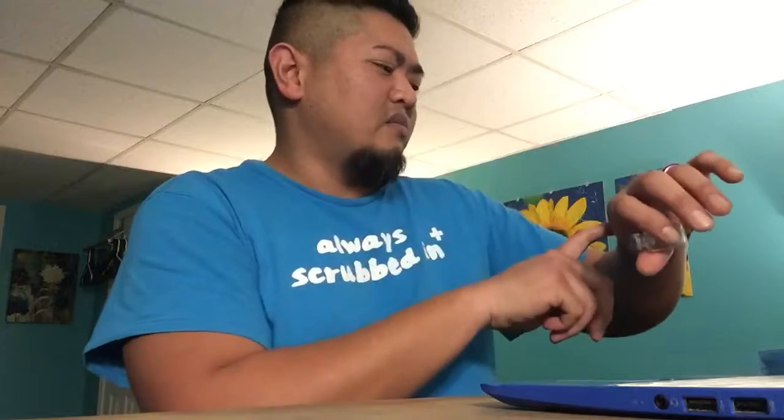After the patient consents, give the patient some privacy, do some hand hygiene, and ask the patient, what is your name and date of birth? While you are checking the patient's wristband, the patient says, Diabetes, 12-12-50. You check Diabetes, 12-12-50. You also check the MAR, Diabetes, 12-12-50.